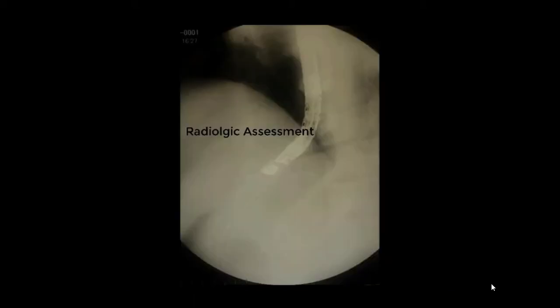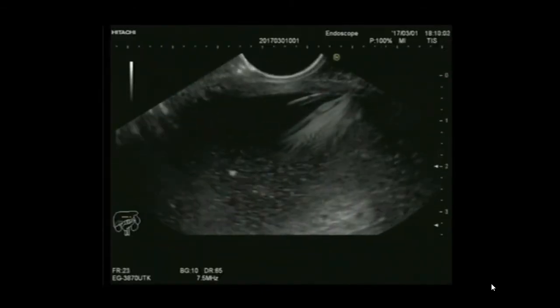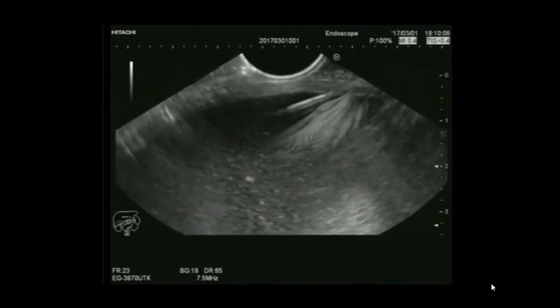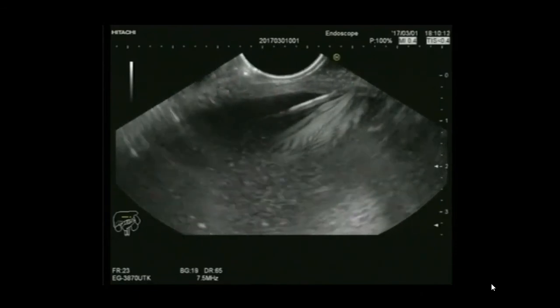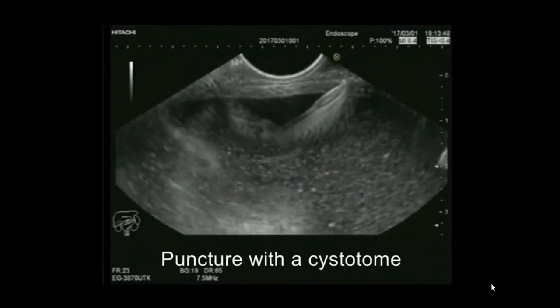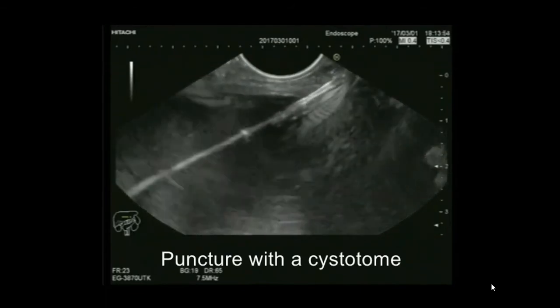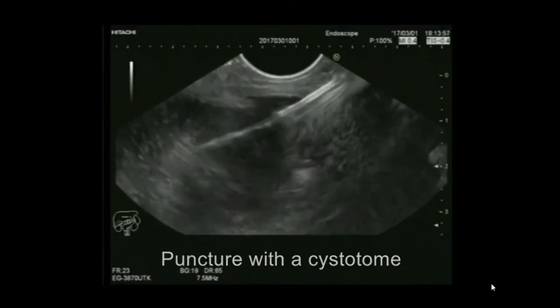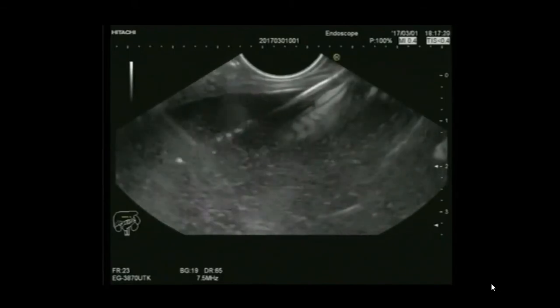We confirm guidewire placement by simultaneous fluoroscopic assessment. Then we use a 6 French cystotome to create and enlarge the fistulous tract. Sometimes, after the cystotome, multiple Suhendra dilators are used, after which an 8–10 mm balloon is inserted to further dilate the track.